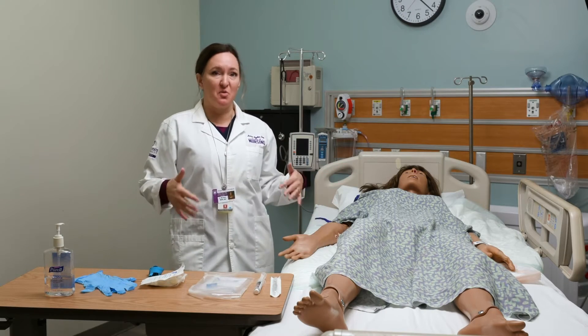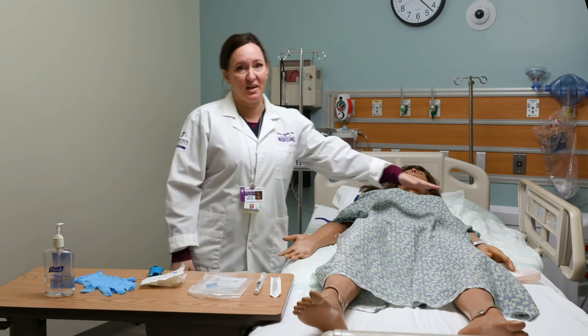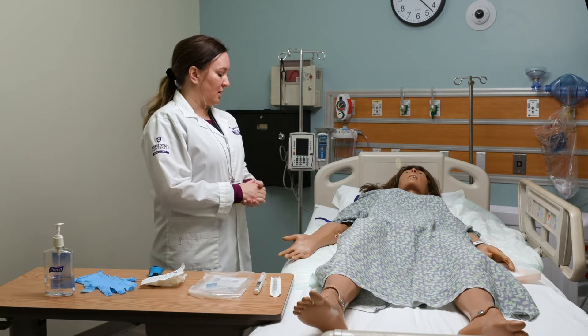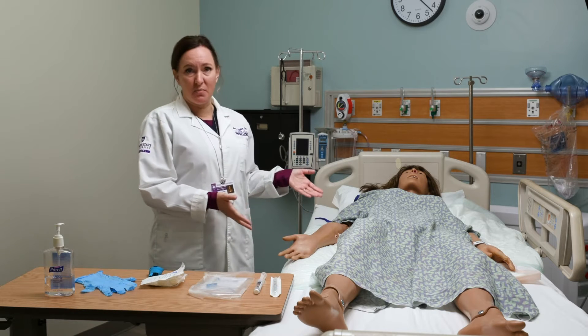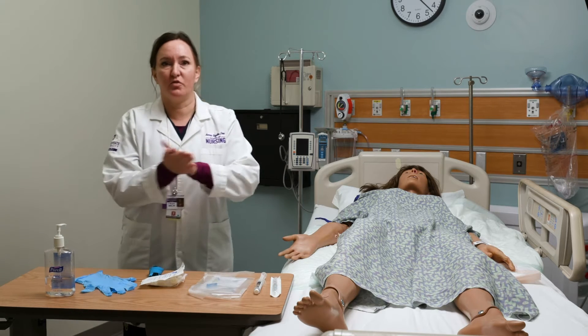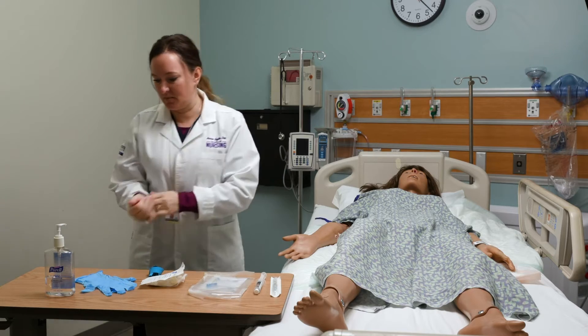So you come into the room and do all the preliminary things — you would identify your patient, we've already found our vein, and I've educated the patient as to why she needs to have the IV today. If you haven't already performed hand hygiene, make sure you do that, and then put on some gloves.